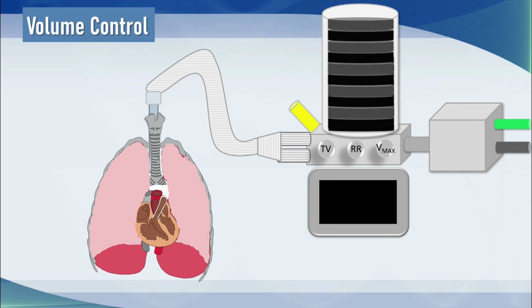When you put a patient on volume control in the ICU, you dial up 3 things: the tidal volume, the respiratory rate, and the peak flow. The peak flow is the speed at which the gas goes into the patient. When the patient is paralyzed, it doesn't really matter what the peak flow is, but if the patient is breathing themselves, that flow rate needs to match the patient demand flow rate, or the patient will become desynchronous.